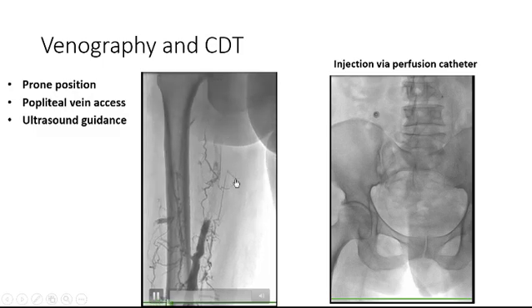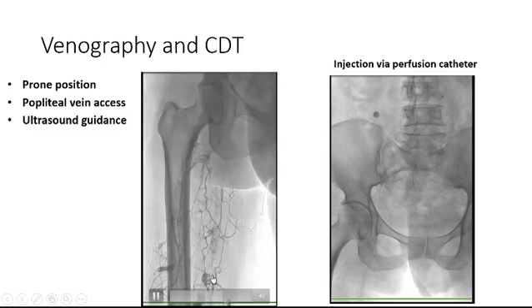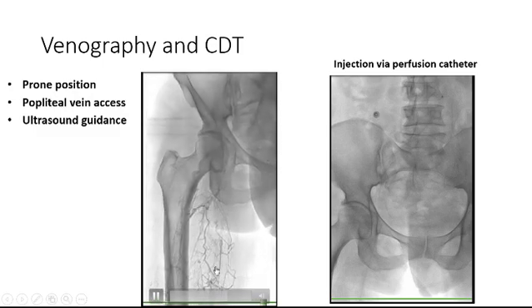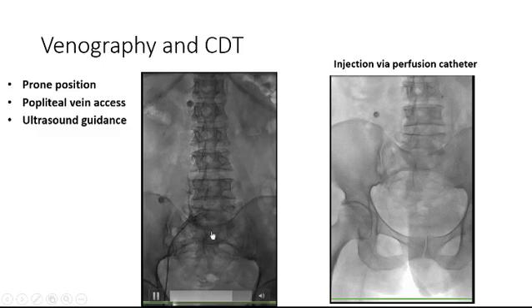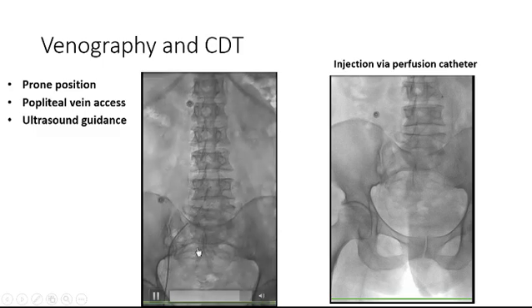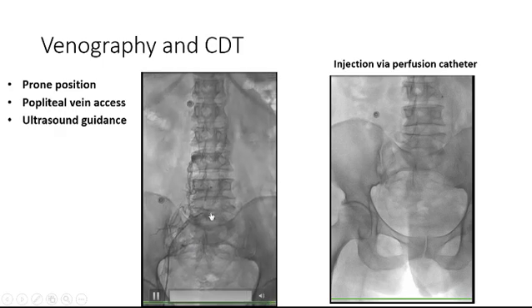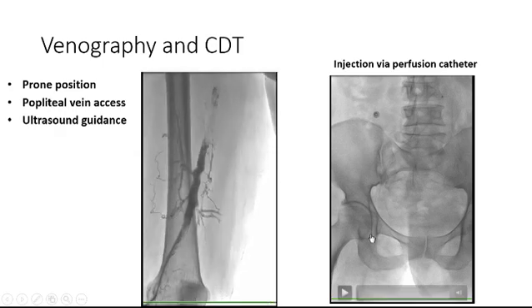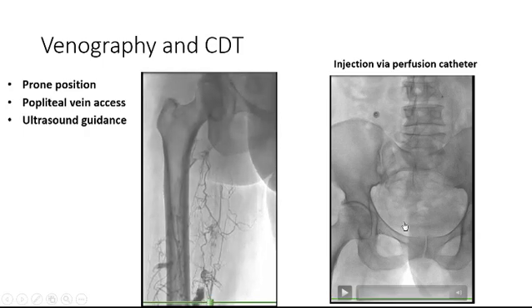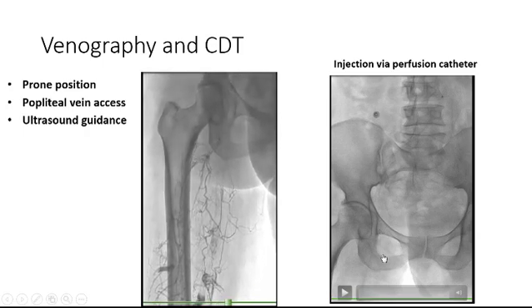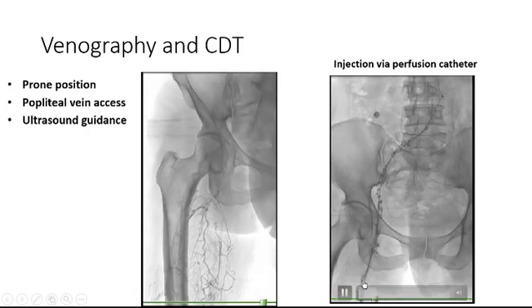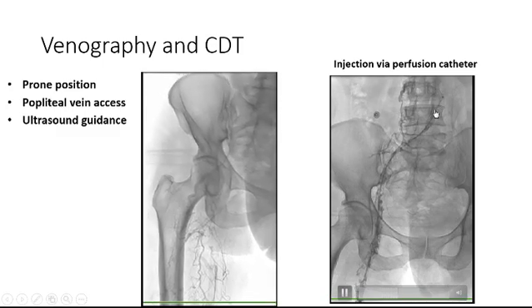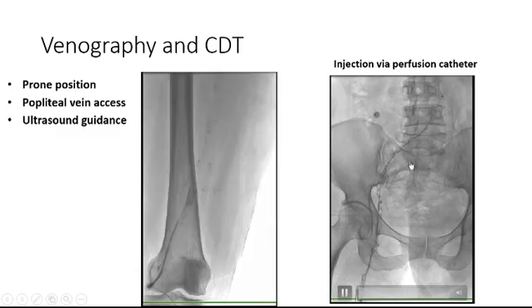You can see large thrombus in the left leg, and catheter injection in the iliofemoral veins shows occlusion of common iliofemoral veins and some collateral perfusion. The perfusion catheter for catheter-directed thrombolysis was placed from the superficial femoral vein to the common iliofemoral vein.